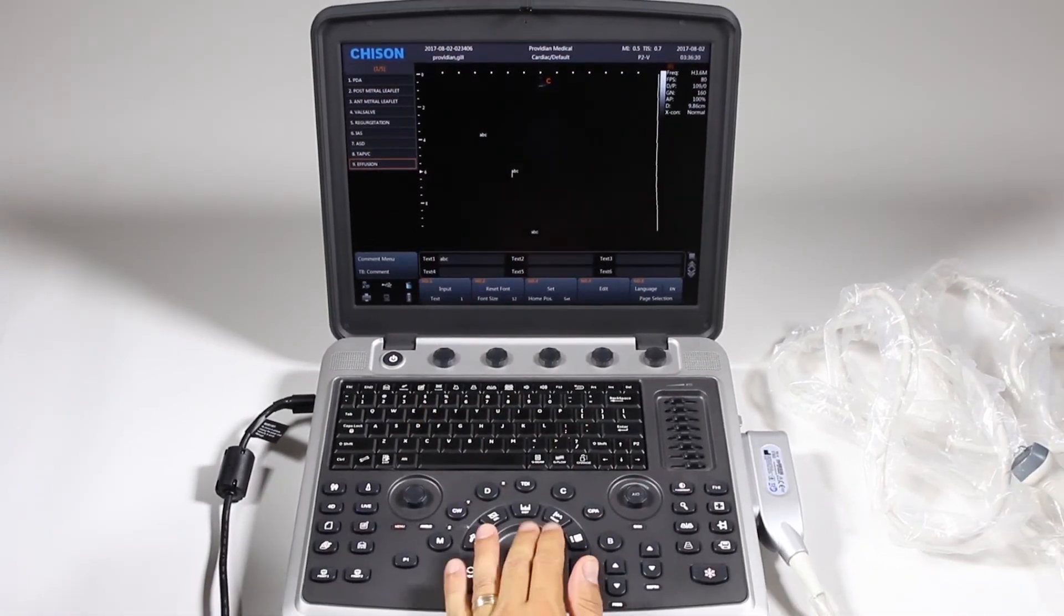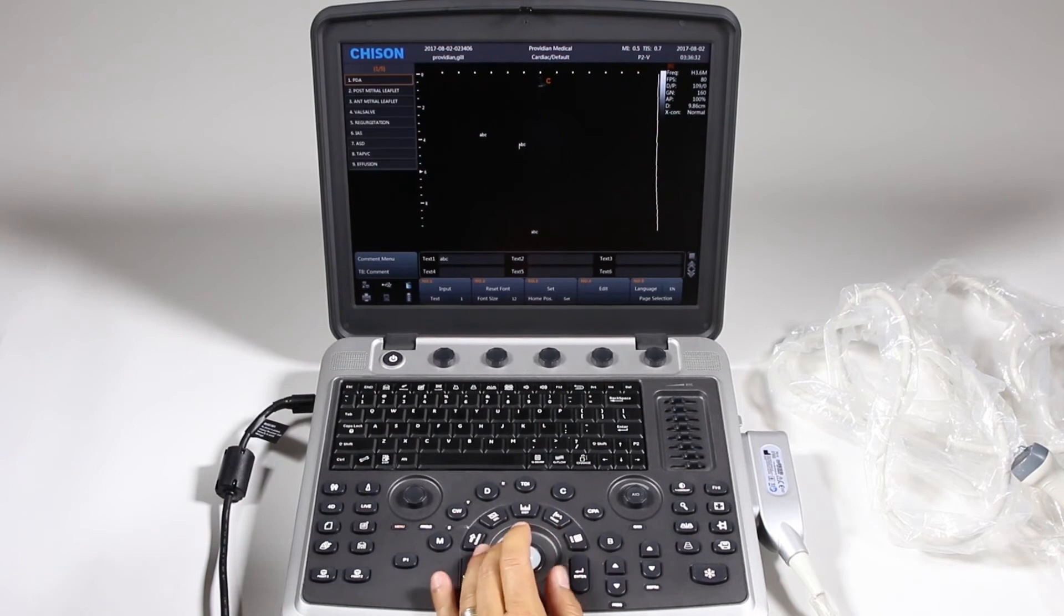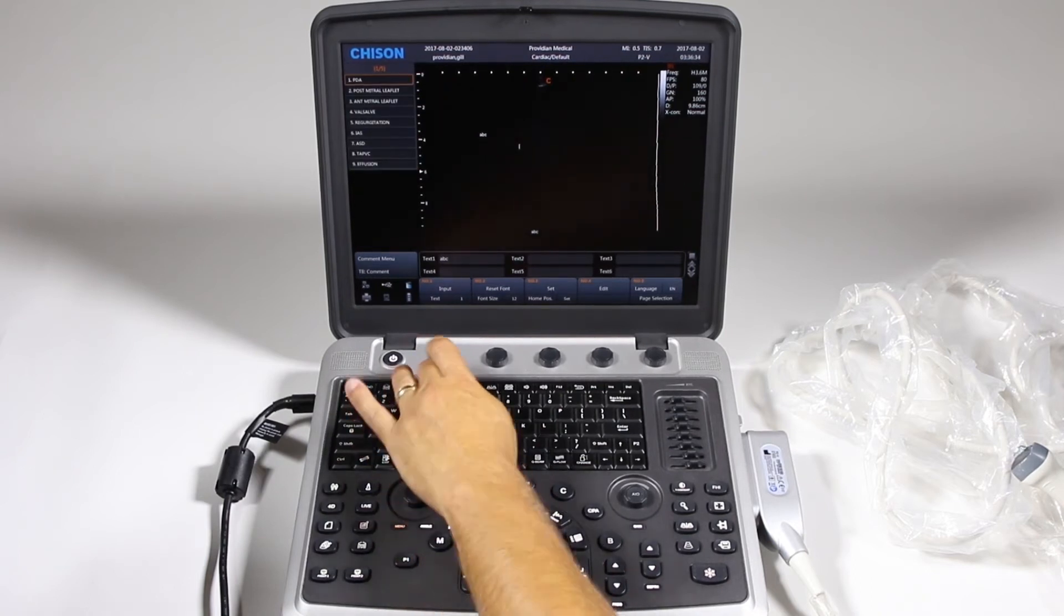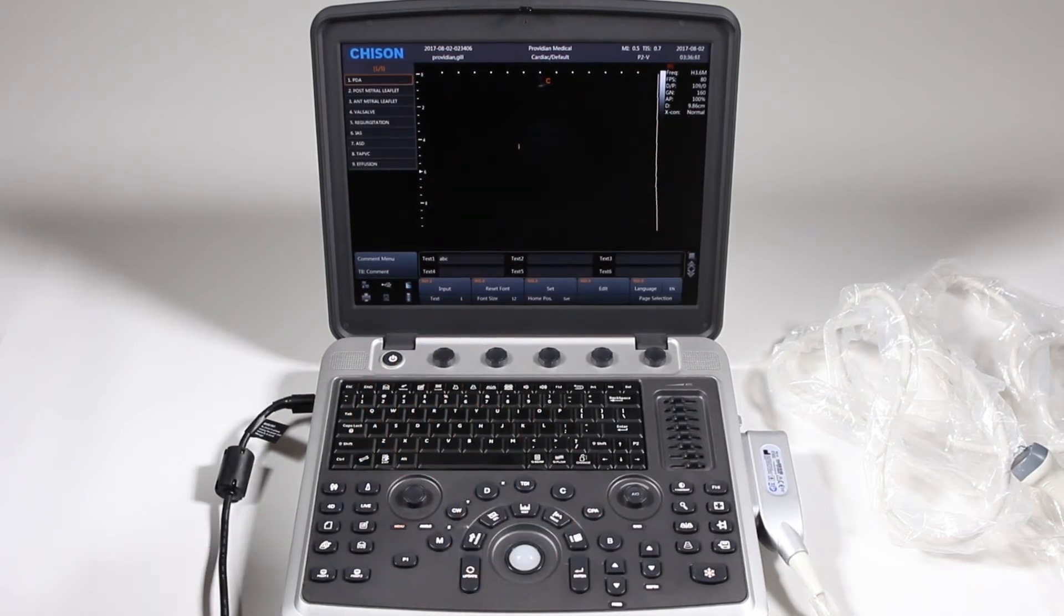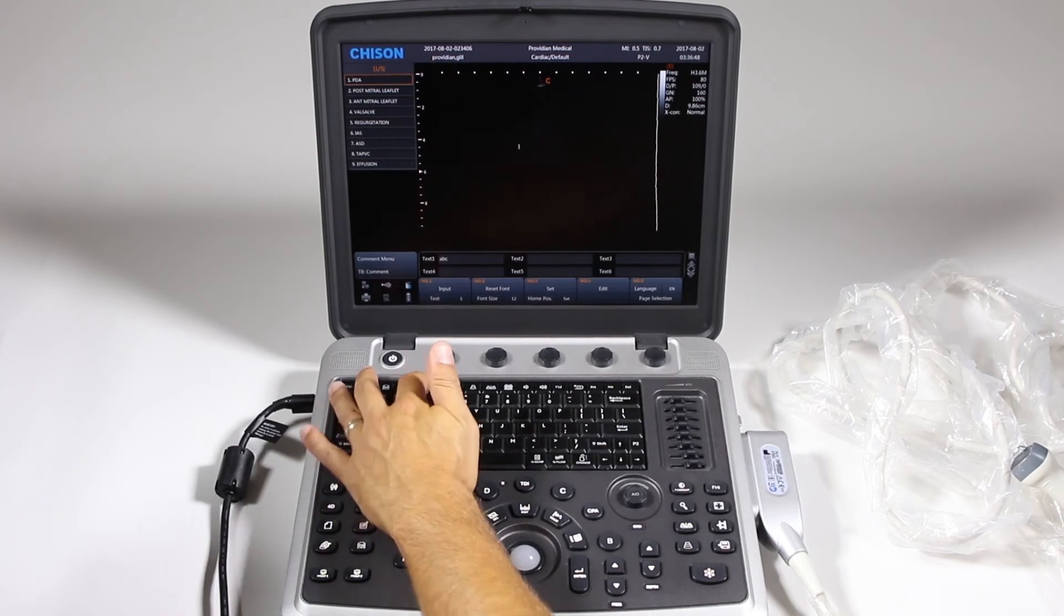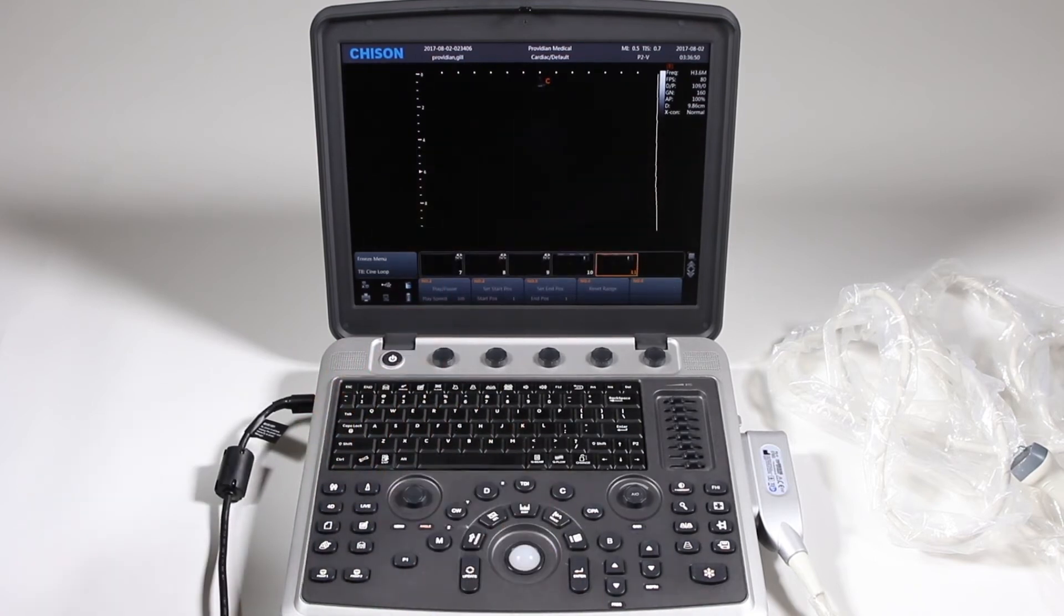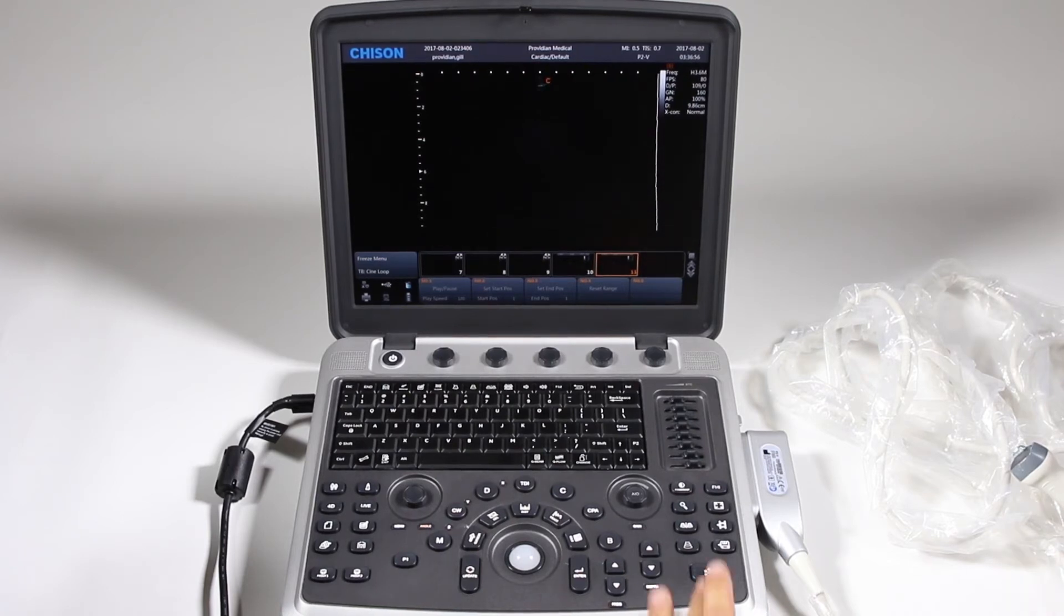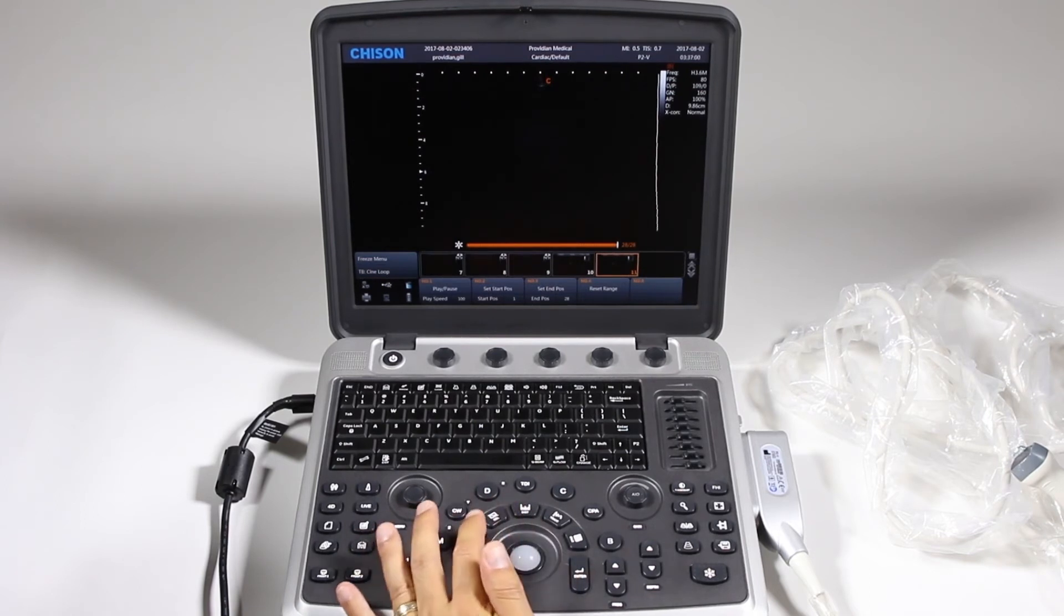And those are there on screen. Again, if you want to move them, put them there, delete or clear. Let's go to measurements real quick. I'm just going to click on the comments again to get rid of that. Now just in a regular imaging mode, I'm in cardiac right now and let's say I've just got my image frozen and I want to take some measurements.